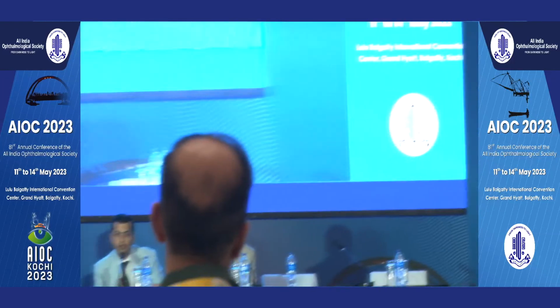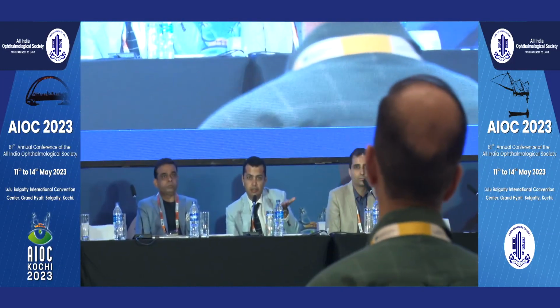Then IQ also we have to rotate. Absolutely, IQ you will have to. It's only the Lisa toric maybe which you can leave like that because it's a plate haptic lens. Also, the lenses have posterior angulation. So that lens is actually like this. If you tilt it, you might also have a refractive surprise because the lens will sit more towards the cornea.